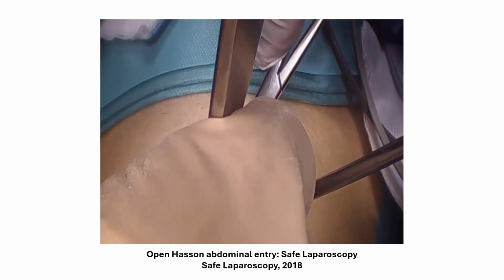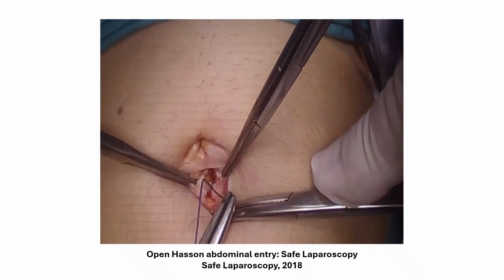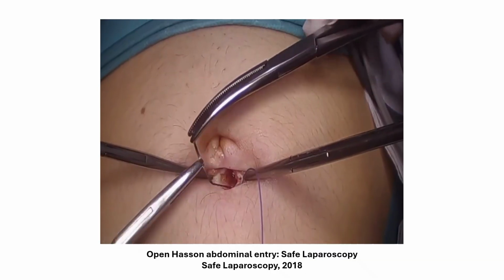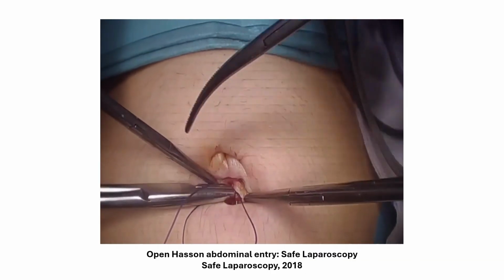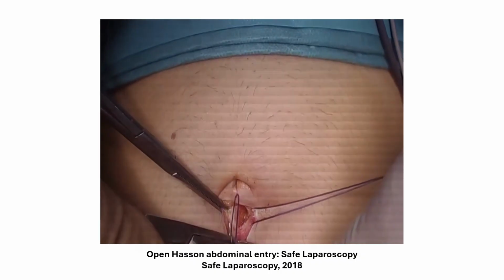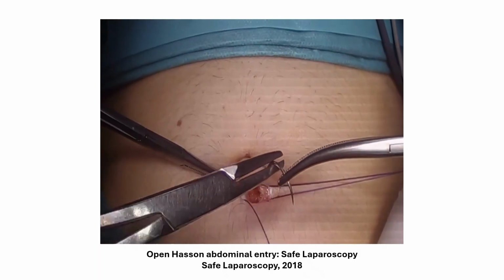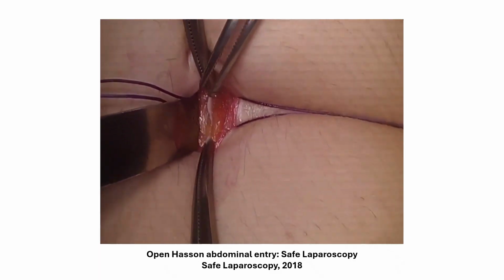You can see right here that the surgeon is throwing a few sutures on either side of this incision. And while they're doing this, I want you to ask yourself, why on earth would they be throwing some sutures in when we're just barely opening up this incision point? And this looks like it's going to be peritoneum.